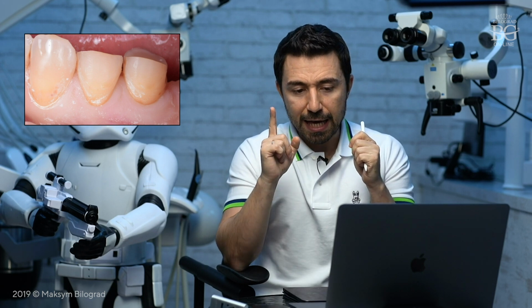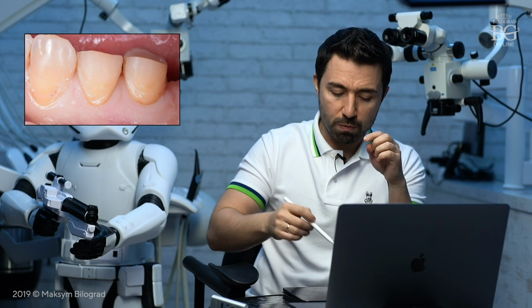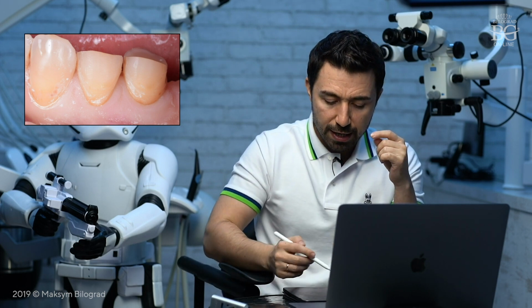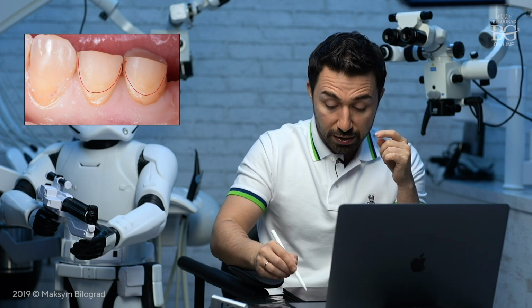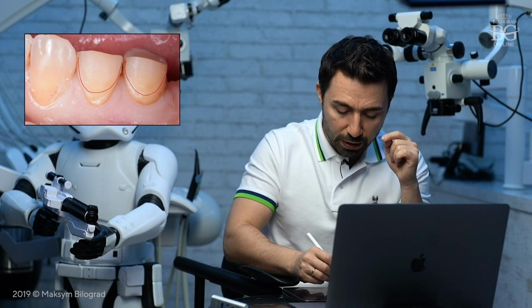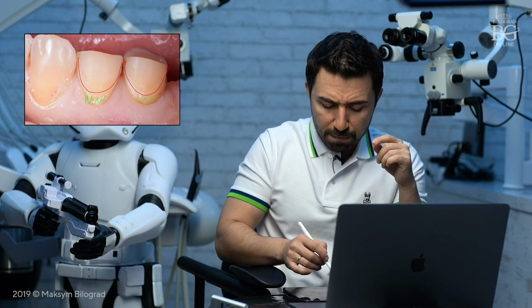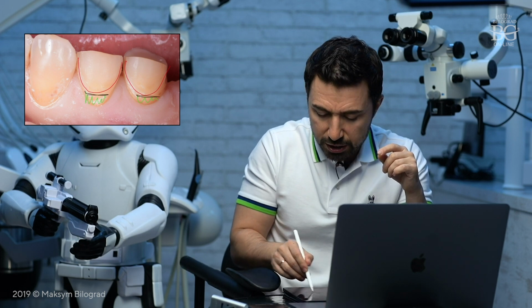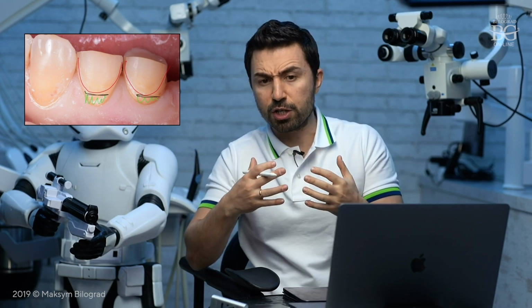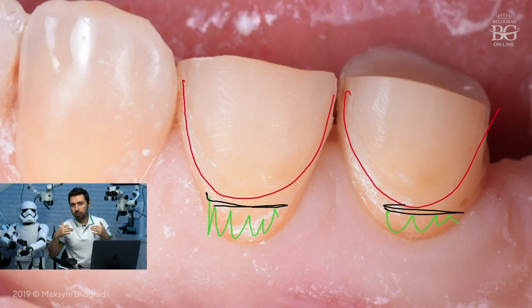And another thing that may happen, you have to keep in your mind. For example, here are my finish lines, by the way, that are in enamel. But for example, I will put composite here, okay, and in some time, there may be some discoloration here between composite and ceramic. Sometimes a brown or black discoloration or whatever. Since it is not a very aesthetic zone, it is acceptable.